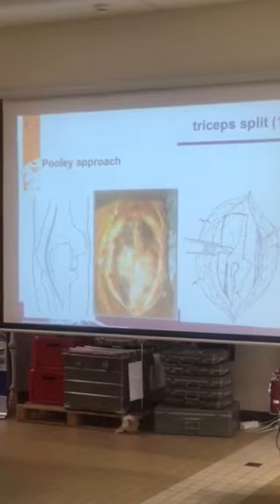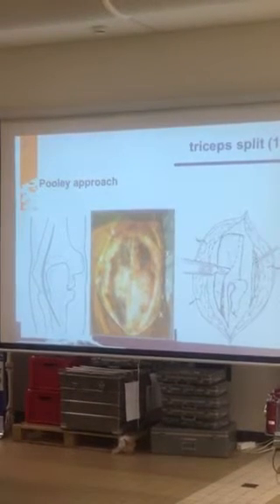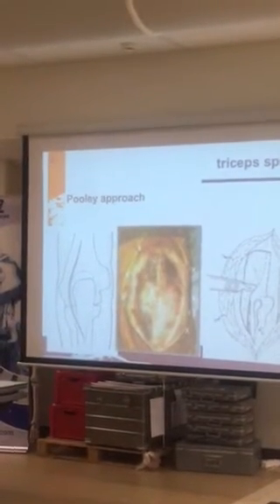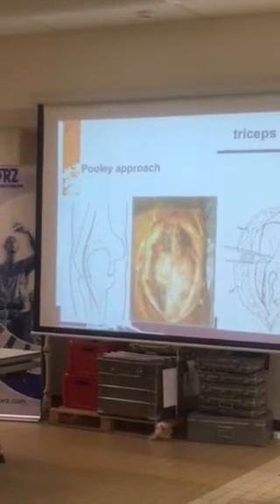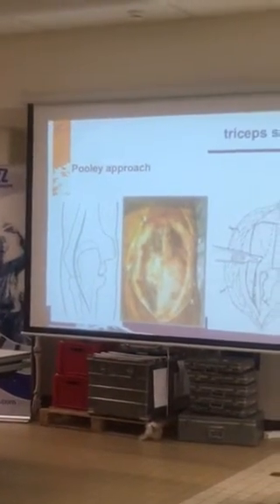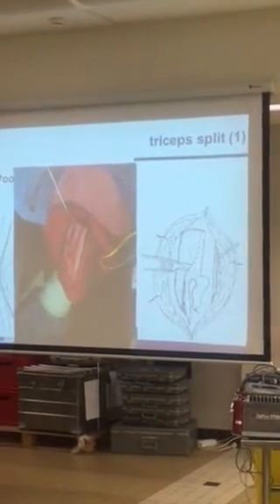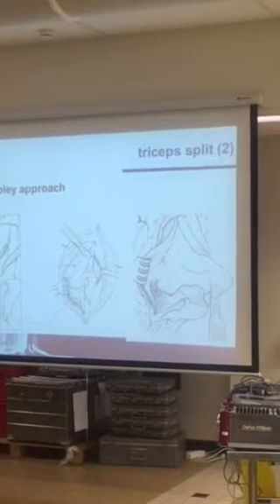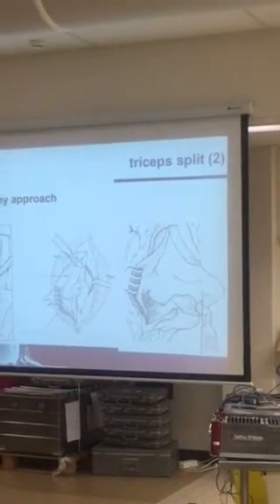So what he has popularized is that you first take off the triceps aponeurosis, which is a thin fibrous flap. You pull it down distally. Then you identify, is there a pointer? Yes, it's a pointer. Then you identify, it's almost hard to see, the raphe. It's a kind of intermuscular septum, which is between the lateral and the medial and long head of the triceps. And then you go further, which you can see, this is the triceps aponeurosis flap. If you go further, then you make a lateral window along the triceps, which means you take off the muscle at the bony insertion.